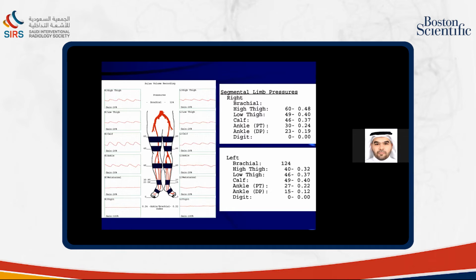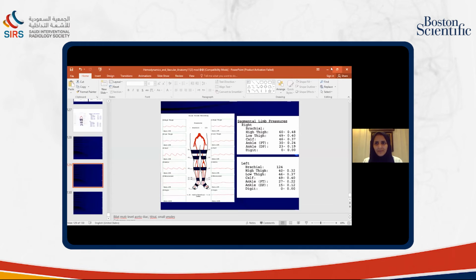If you have questions, please submit them through the Q&A box and I will be happy to answer them. In the meantime, I'd like you to focus on the last examples Mona just showed you, because they are really exam questions. For these examples, you need to evaluate 3 things. You look at the ABI, and also the segmental pressure. She just said that the segmental pressure difference should be within 20 millimeters of mercury. If it's more than 20 millimeters of mercury, then you would suspect underlying disease. And the last thing is the PVR, pulse volume recording. She already showed you the 5 categories where you can classify the disease, from normal towards vascular occlusion.